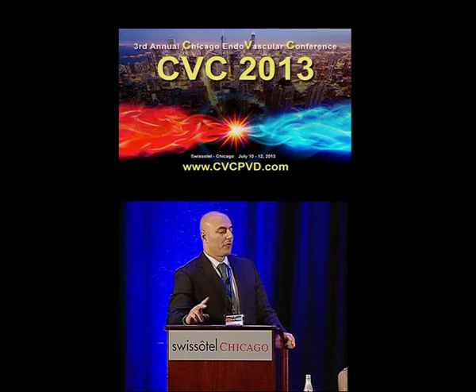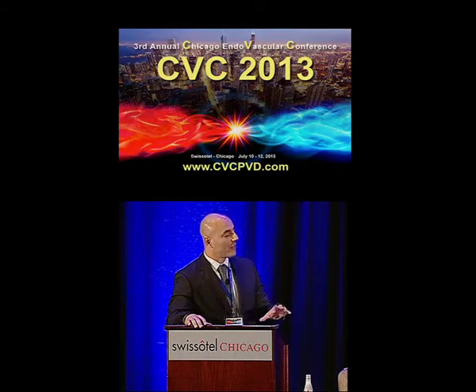There's two things that we factor in. A lot of cases we have done it this way with balloon angioplasty, and it's exactly as you mentioned. The pressures are very low, 60 over 0. It's very powerful. As soon as you do a little bit of angioplasty and there's some recanalization, the blood pressure goes up and patients have somewhat stability.